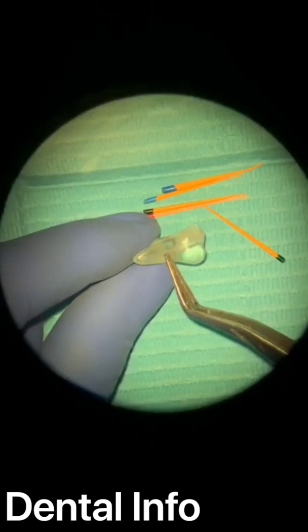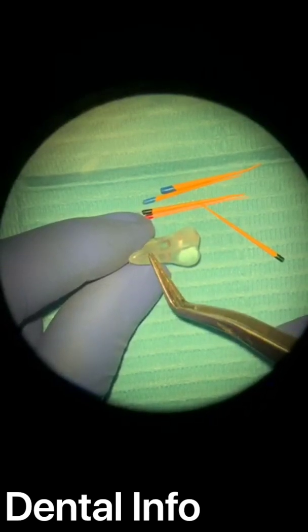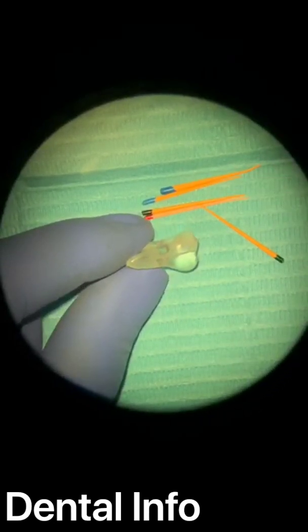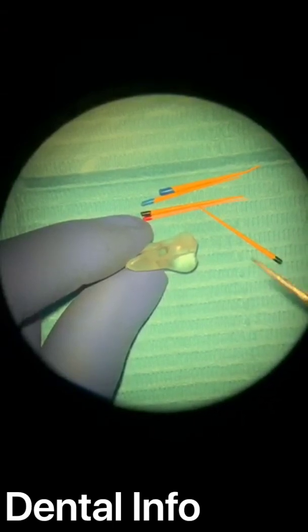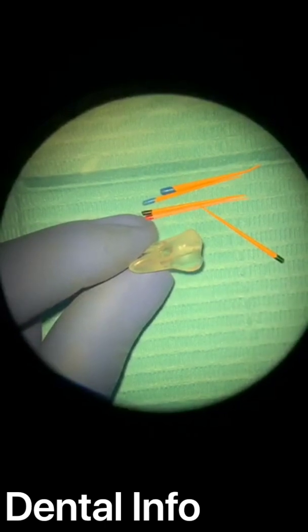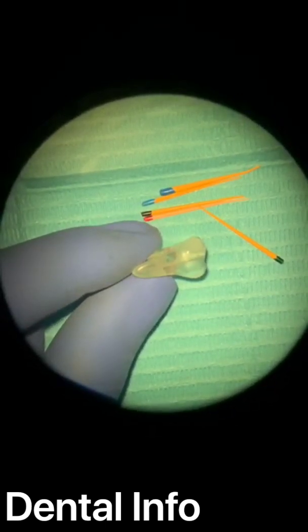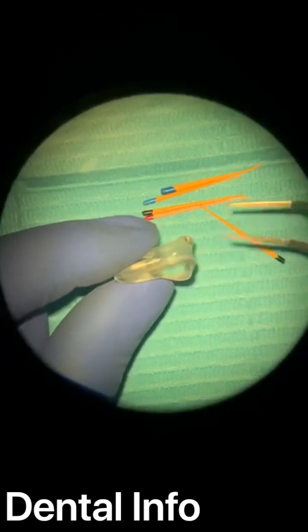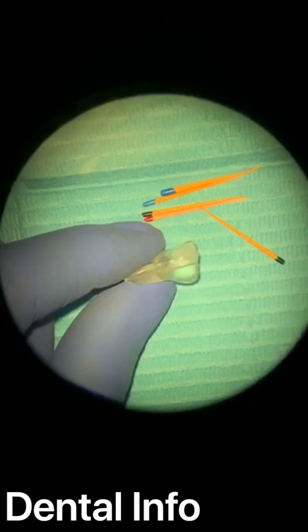As I said, here I prepared this canal up to 25/06. Okay, some people will say, okay, why you don't bring 25/06 cone and put it in the canal and that's it? Okay, but that's wrong. Why? Because not all canals are cylindrical or are tapered. So we don't have an ideal canal, right? So we always will have some spaces.